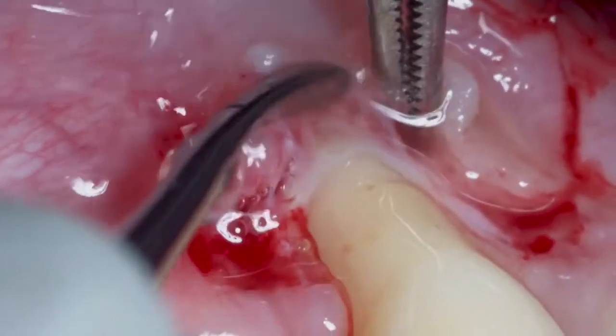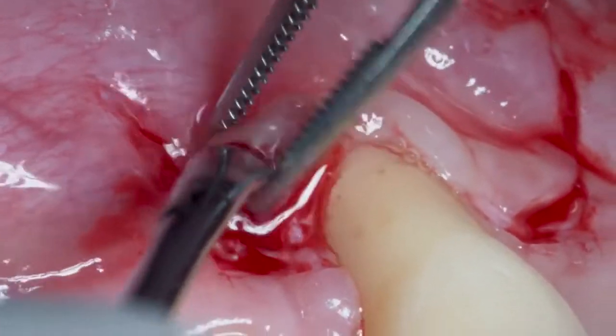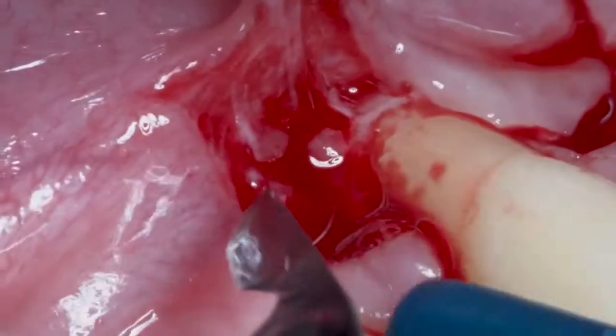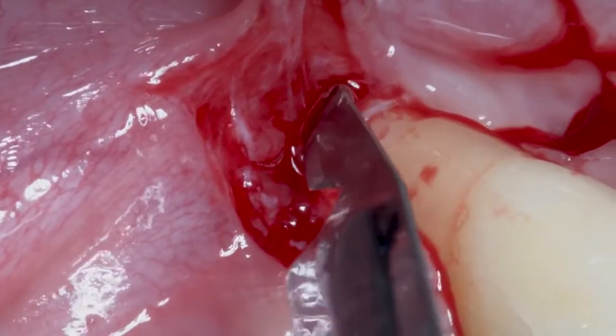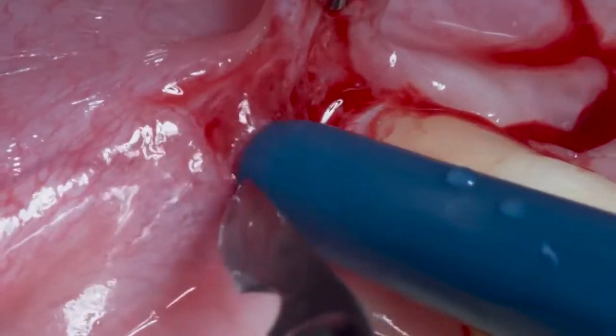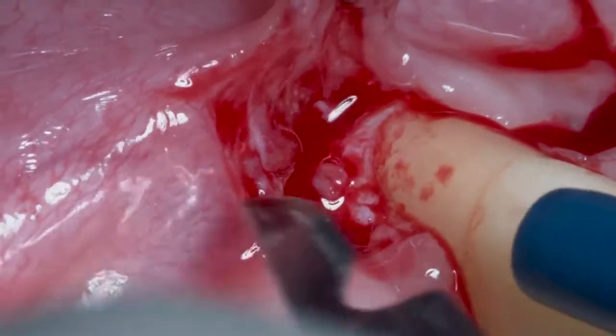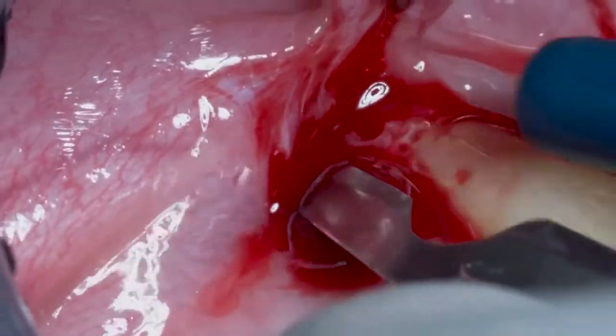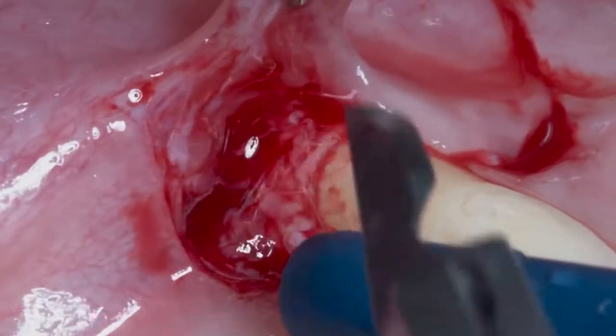You also have to be very careful in raising the full thickness flap apical to the recession, because you don't have any sulcus. It is very difficult to get a full thickness flap in the apical portion of the recession without damaging the flap.